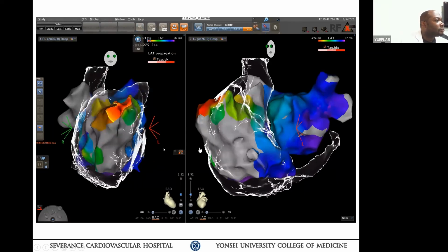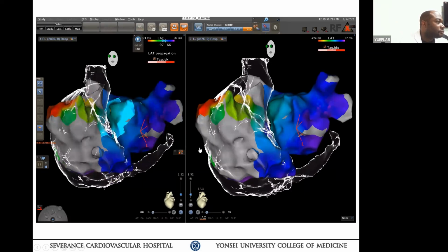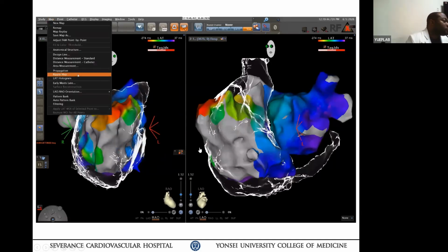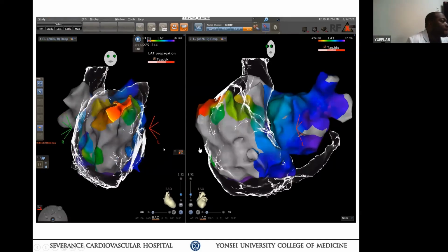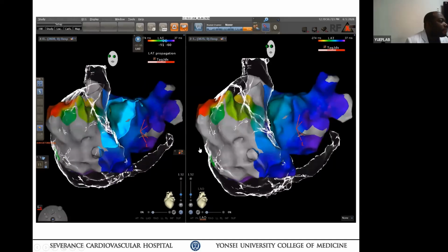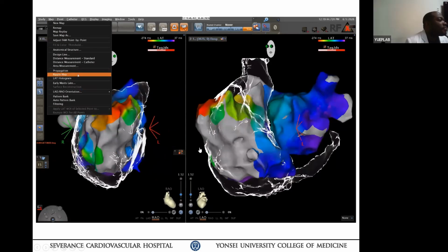Has the size of the atrium progressively increased? Yeah, I think so. So definitely this patient has atriomyopathy, progressive atriomyopathy. And I'm wondering whether the patient has restrictive cardiomyopathy. He will get AV block in the future because the crista terminalis pathway is blocked by CT ablation.